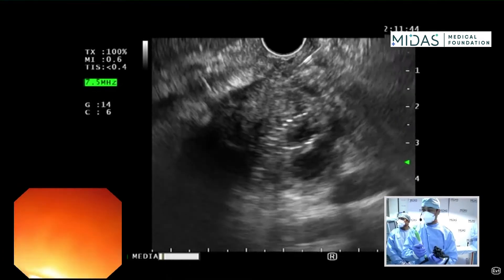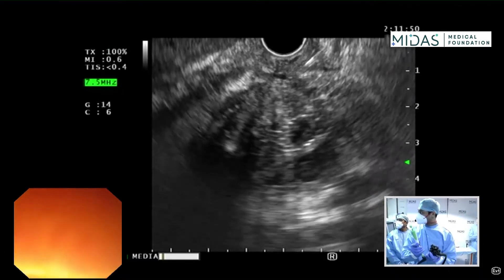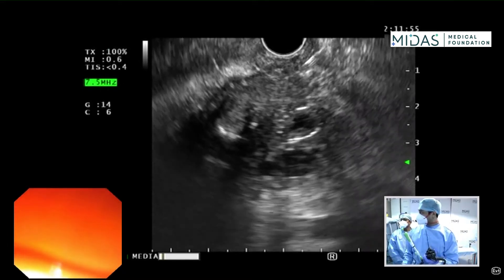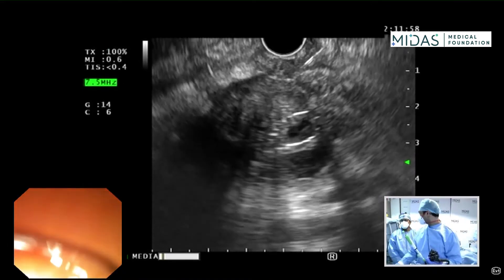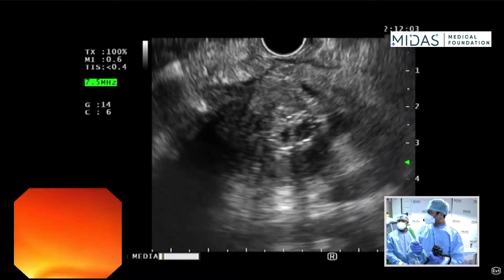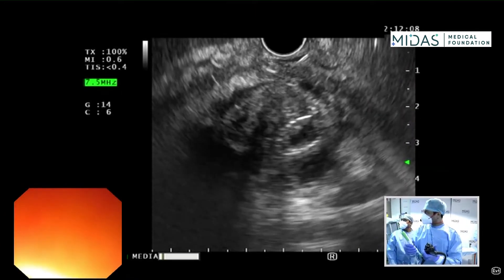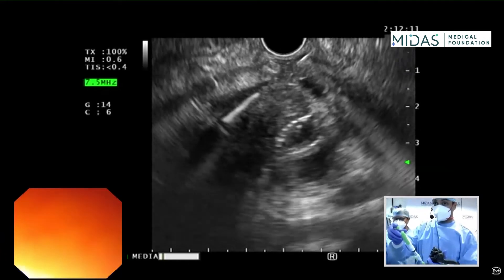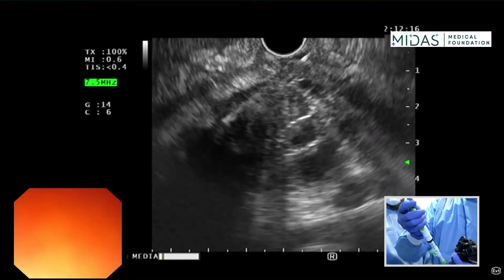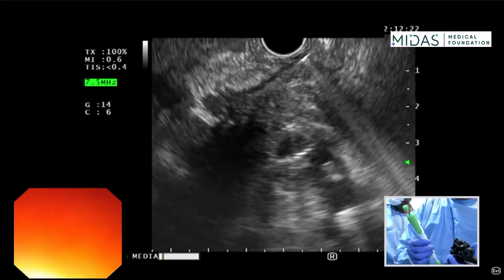In this case I'm going to use a slight elevator, just a little bit. Then I'm going to advance the needle — I like to jab it. I'm going to push the needle out again. Now we have the needle in place and I'm going to push the stylet out. Although it's at the edge of the periphery of the lesion, we'll reposition it. I push the stylet out to clear any duodenal contents.